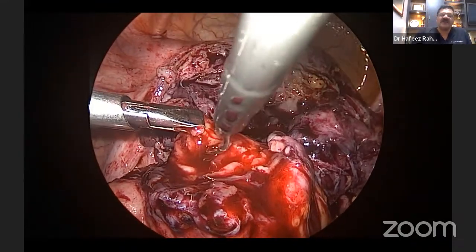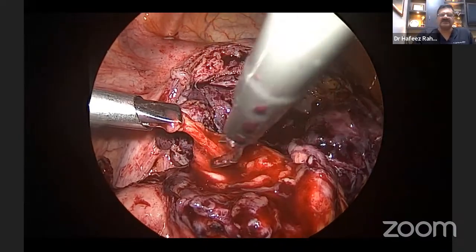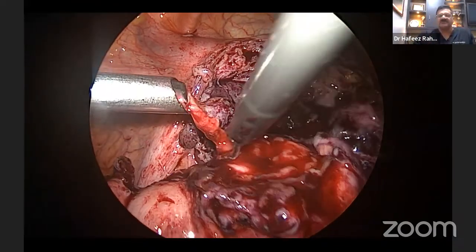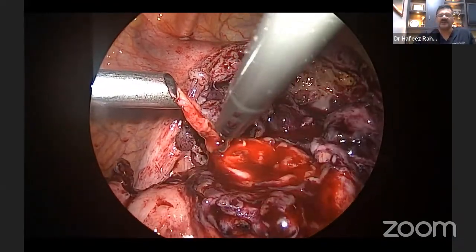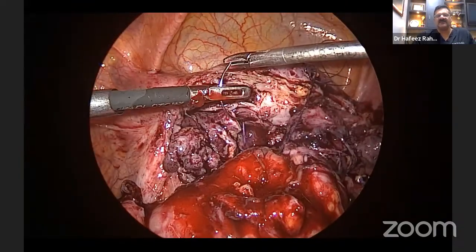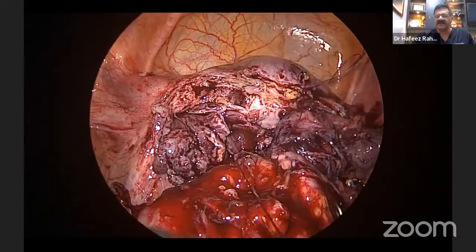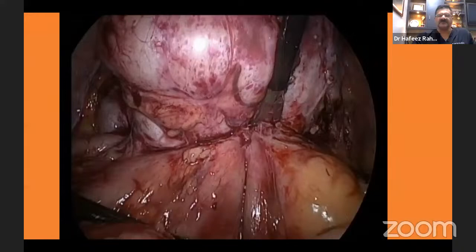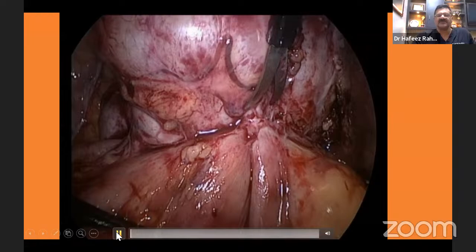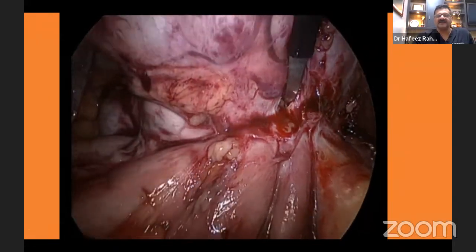So in these kind of chronic fistulas, it is very important to, it's not like a bowel injury. You can see there is no raw area to classify it as a bowel injury. It's all a formed area. So you need to excise that mucosa which is sprouting out and then only repair the bowel. Same as a vesicovaginal fistula, where you need to excise the fibrous area and then repair that fistula. Now here you can see another bowel complication which has occurred.